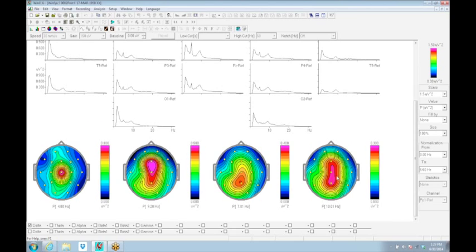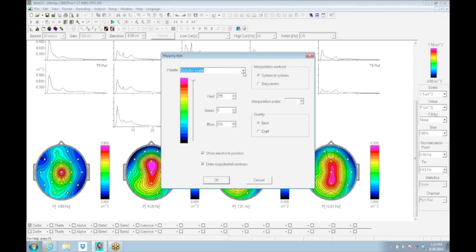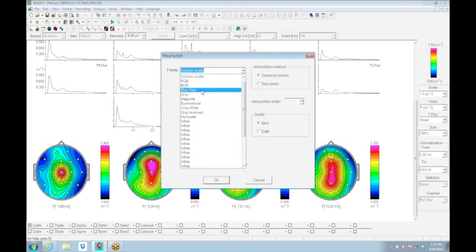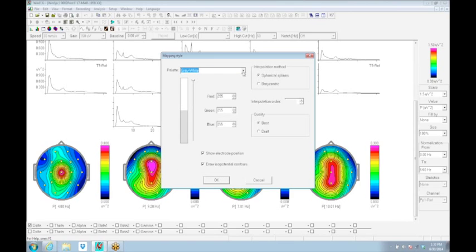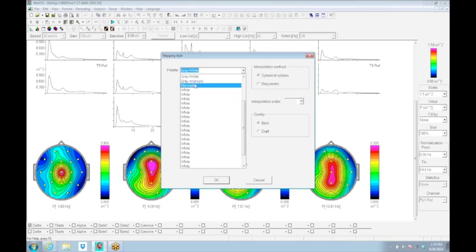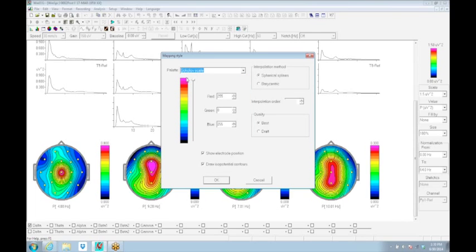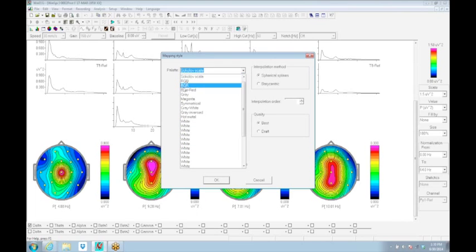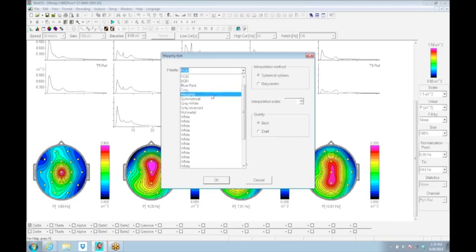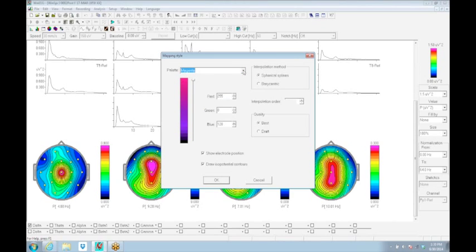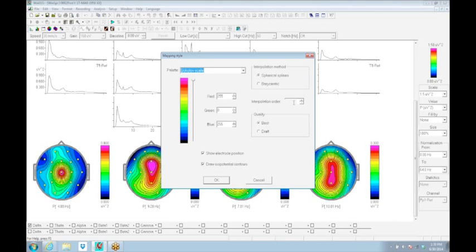These displays can be altered. If you go up under setup, under mapping styles, you can change the color scales for people who have to print into a journal that only does things in black and white. You can do gray scales. There's all sorts of alternatives for these. I like the kind of ROYGBIV rainbow colors going to black for absence. That's my preference. But there's lots of various color scales: red, green, blue, you name it. Pick whatever color scale you particularly like.